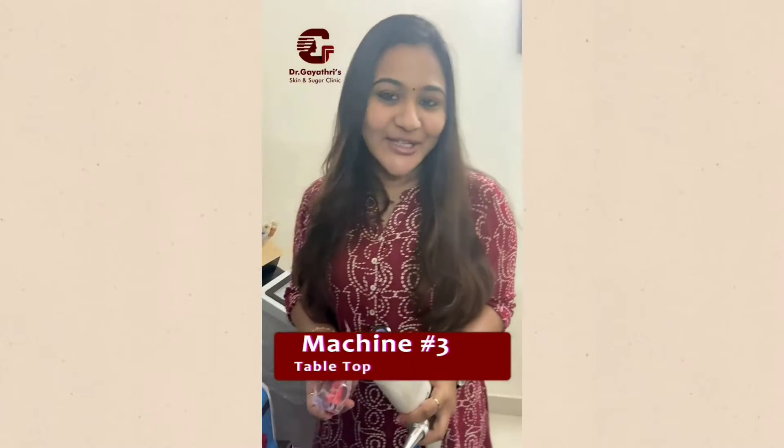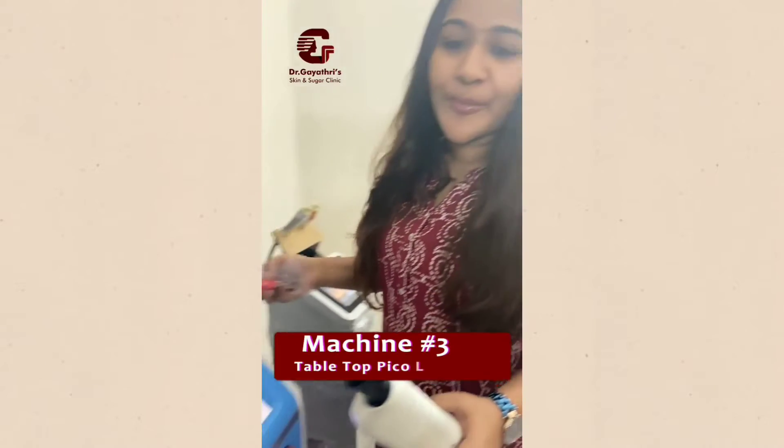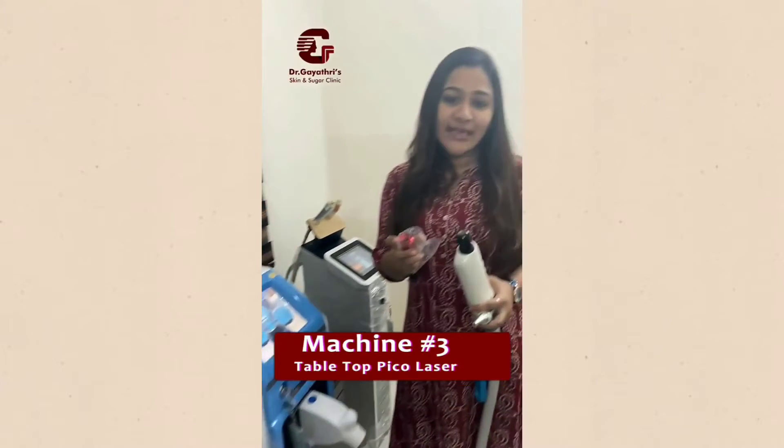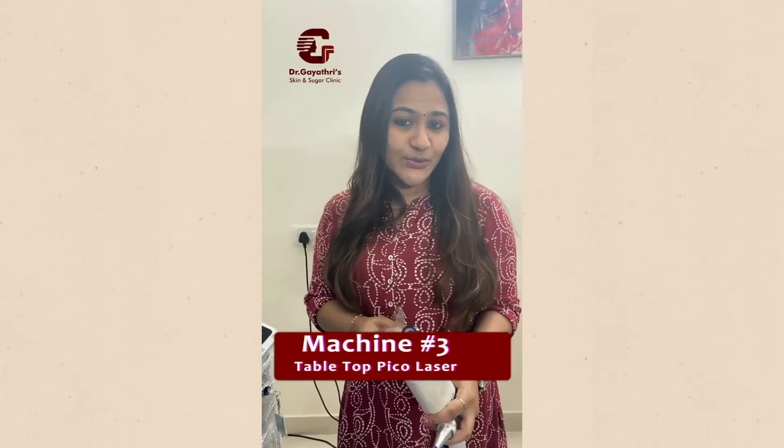Hi, so many people actually wondered what procedures I've been doing and what machine it is. It's the tabletop Pico laser — and Pico refers to the picosecond at which the laser shots actually hit onto the skin.